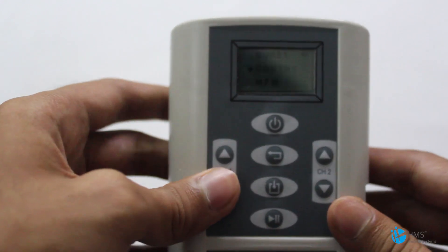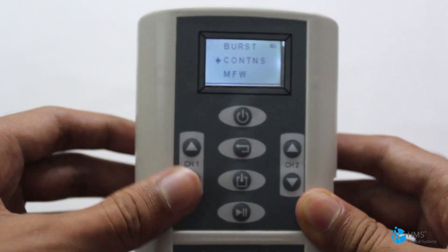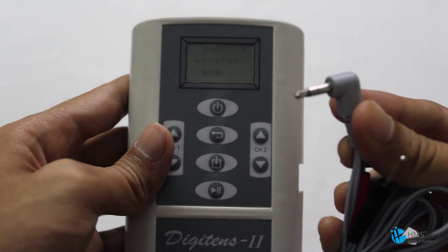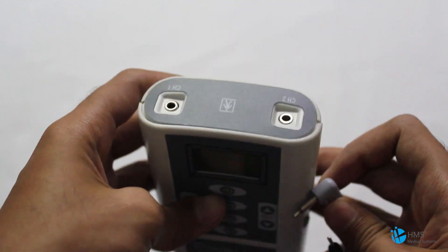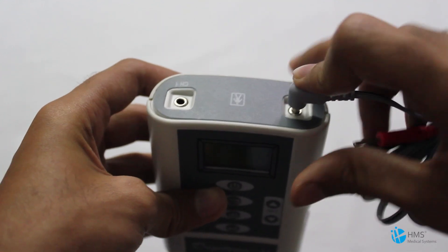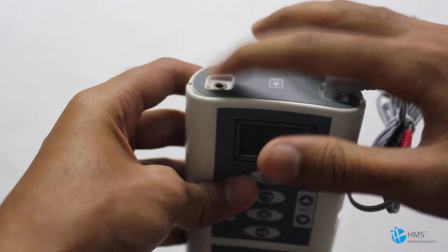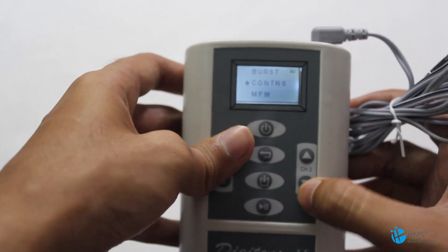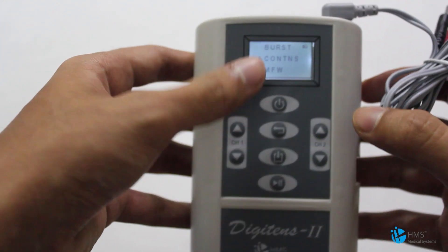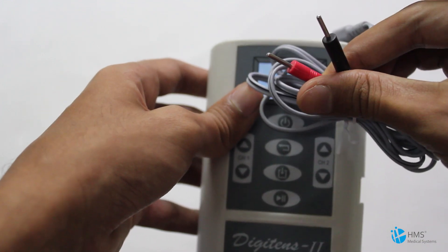It's highly advanced and there is no one in the competition with these kind of features. The insertion of the electrode cables is very simple — just put the cable here, and another cable to Channel 1. This channel controls the intensity level for individual channels, and at the other end you connect the electrodes.